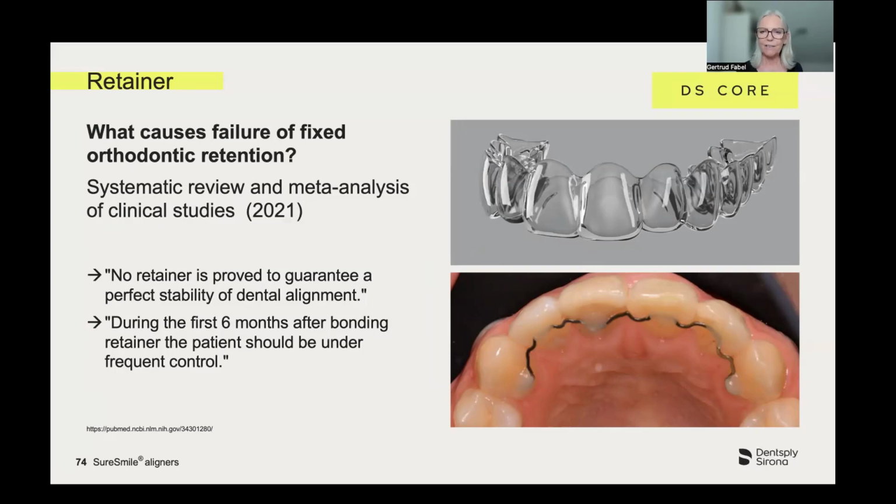I prefer having fixed retainers in the lower teeth and loose retainers in the upper ones. SureSmile recently offers a very affordable system of retainers. I'm a great fan of those retainers, which are supposed to also stand clenching and grinding. So I use those for the upper ones and fixed retainers for the lower ones.